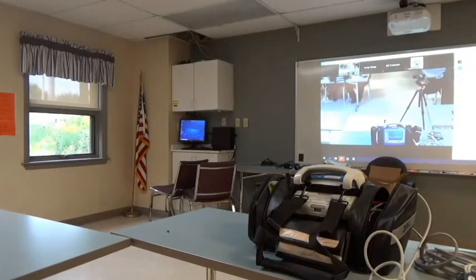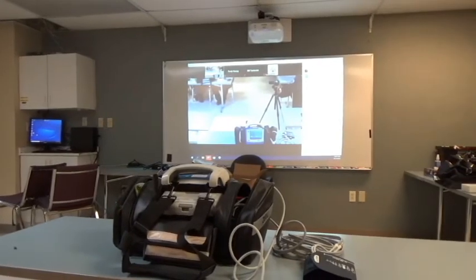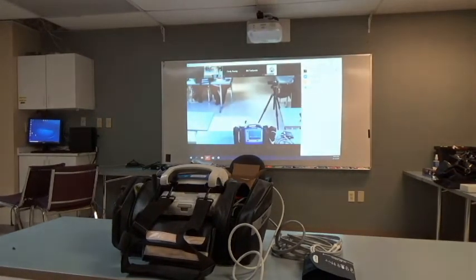There's your yellow, but it looks like it's being paced. No, it's not. Oh, you guys are still in sync. That's what you did. So hit your sync button. Not for the pads. You know what I mean? And we didn't start pacer yet. So bring your output down. There you go. Start pacer first.